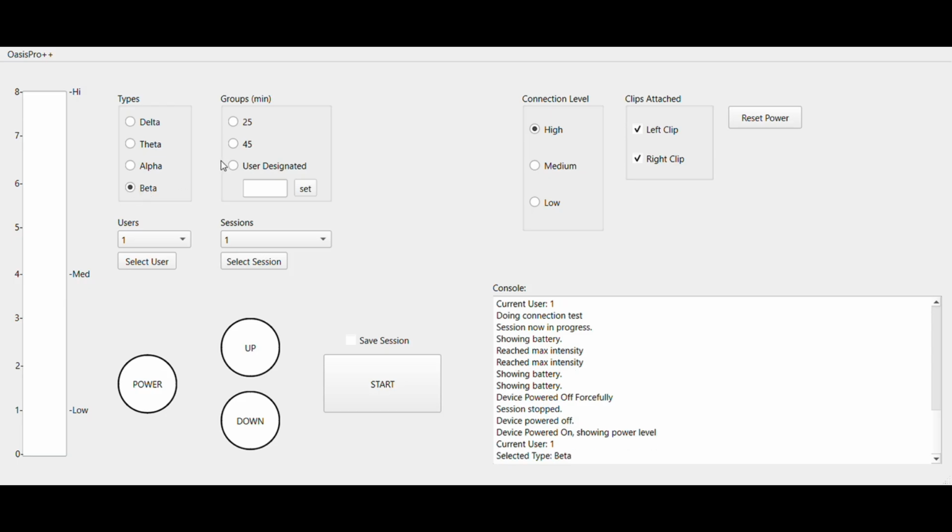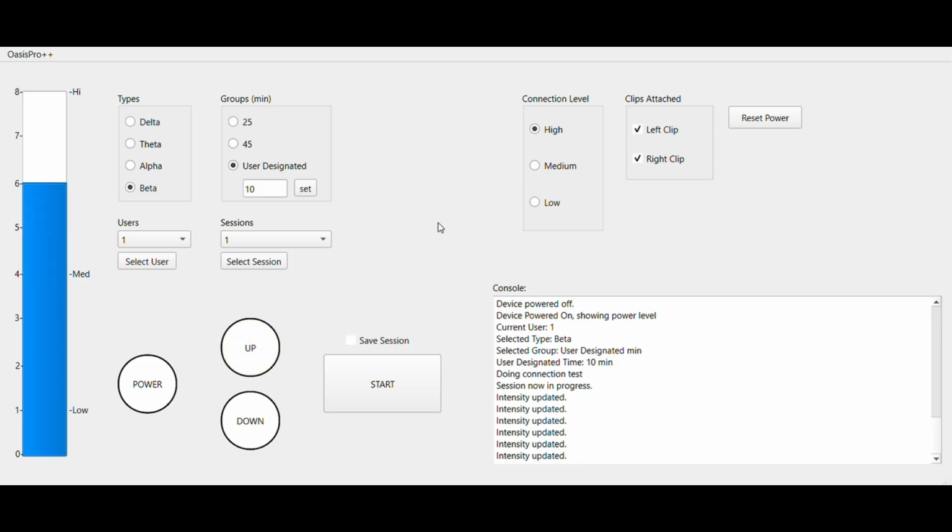You can even set different time here. So I can do a user designated, and I can set it for 10 seconds, just have a quick little session. Hit set, it's 10 seconds, and I can hit start. I can up the intensity, and this will just go for a quick 10 seconds, draining the battery once.